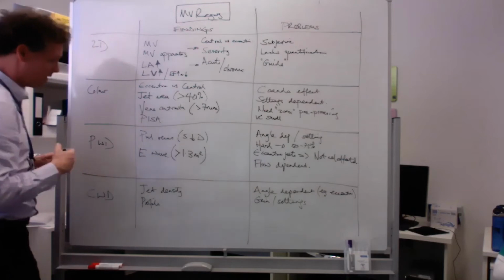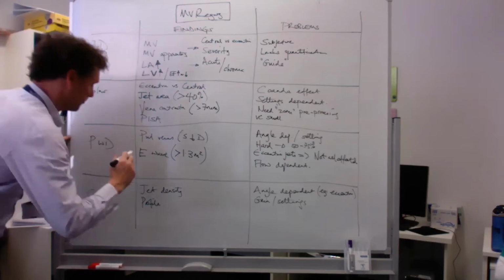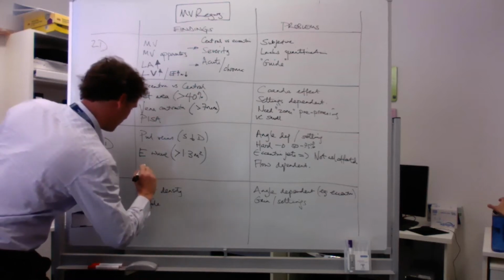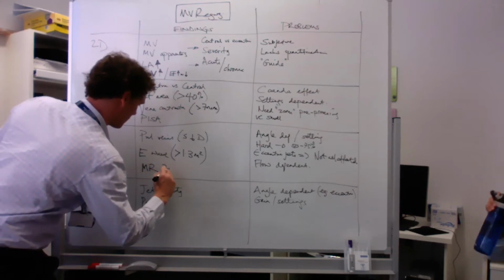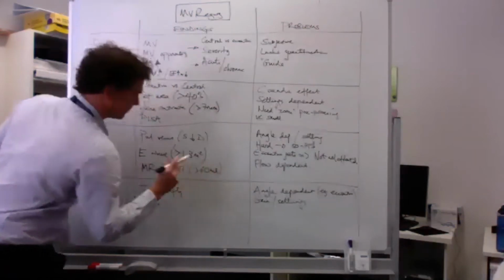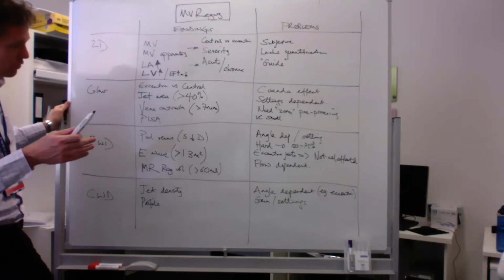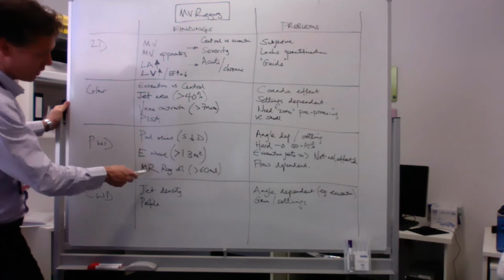Very nice. And how are we going to do that? So we're going to look at the mitral valve inflow stroke volume and subtract the left ventricular outflow tract stroke volume. That will give us an approximate amount of regurgitant volume, and over 60 ml is severe. Did everyone get that? So comparing the blood flow going out of the ventricle to what's coming into it. If you've got the difference between the two of those, you can get the regurg volume.